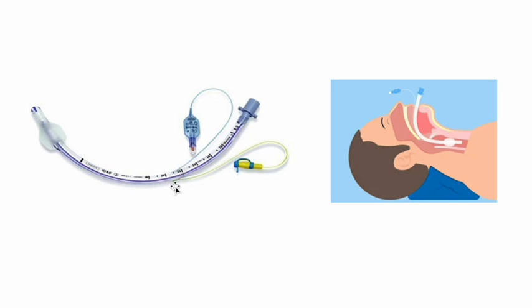And what are the risks of leaving an endotracheal tube in place for longer? So the issue is that the endotracheal tube is very irritating to the surrounding laryngeal tissue, vocal cords, and epiglottis. And leaving the tube in place for a prolonged period of time can lead to the formation of granulomatous tissue, ulceration, vocal cord paralysis, irreversible tracheal stenosis, and importantly, laryngeal edema. And in particular, laryngeal edema can be fatal, since when you go to remove the endotracheal tube, all of the surrounding laryngeal edema and swelling can cause the airway to close off, which we'll discuss later.